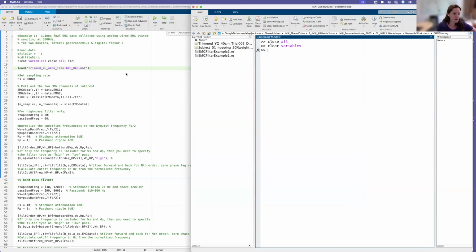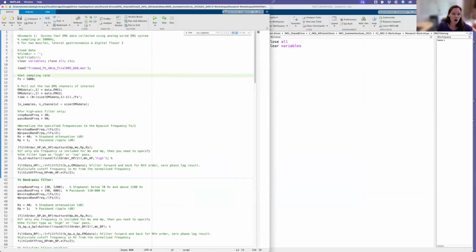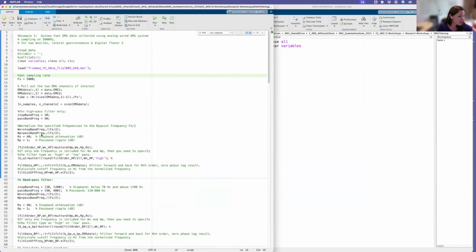First I was just going to walk through an example data set, but there are some general principles that we can talk through along the way. It would be most helpful if this is interactive and actually focused on what you need to learn about EMG filtering. So it's helpful to know what past experience you have with filtering in general. What do you know about filters? So we can talk about filtering principles as well.